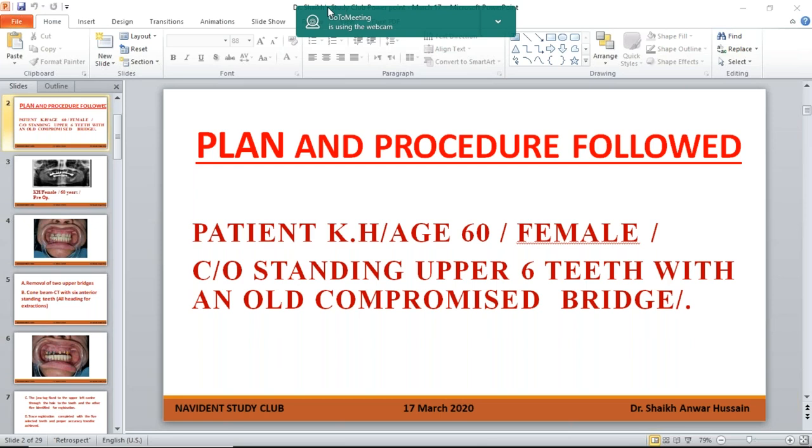Looking forward to that. The question refers to the fact that he has been using static guides, and the case he presented compared the level of accuracy of an artificially flawed guide with a right guide. So based on your experience, now that you are using dynamic navigation, in which area would you clinically adopt a static guide rather than a dynamic navigation tool like Navident?